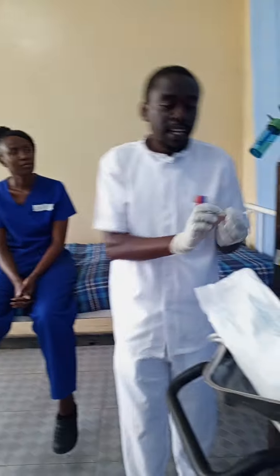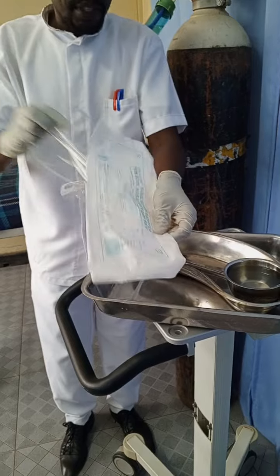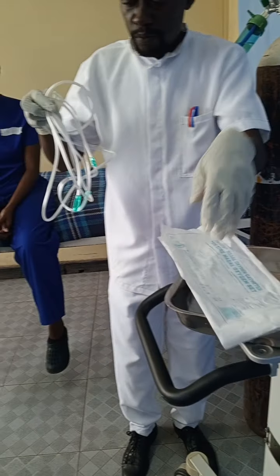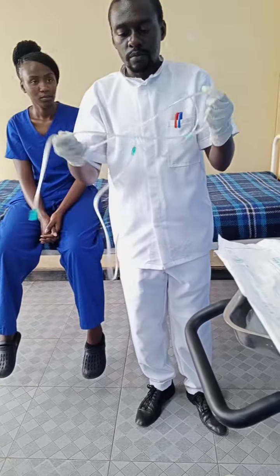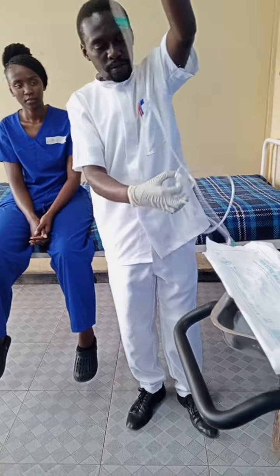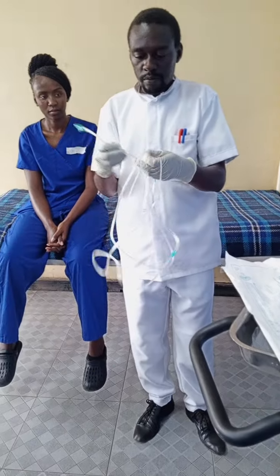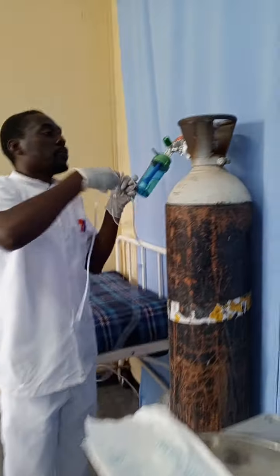After cleaning the nostrils, I'll get the nasal catheter, which I'm going to connect to the patient. I'm going to connect it to the humidifier.